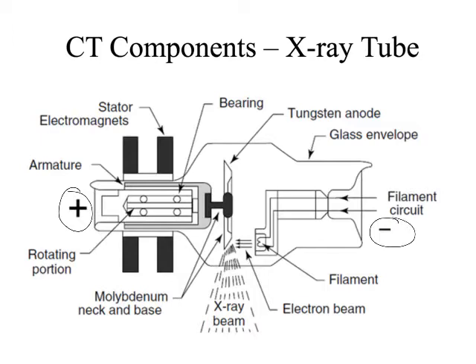And both of them are made out of tungsten, right? For the most part in CT tubes. Nothing's really changed with that. Every now and then we make them out of gold, but for the most part they're made out of tungsten because tungsten has a high atomic number, but it can also cool very rapidly, and it can take a whole lot of heat, right?